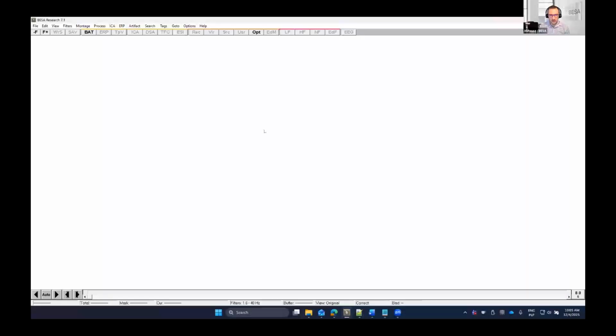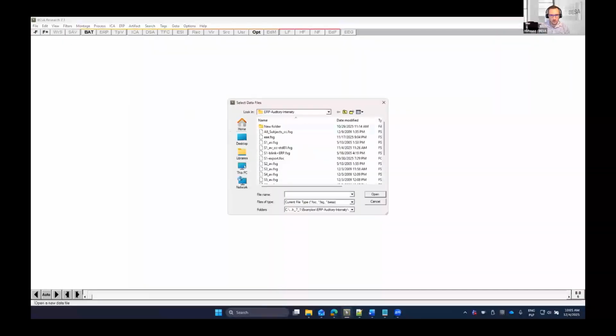I hope you see my screen now. Is it working, Harald? It is working, yes, thank you. Yeah, wonderful.